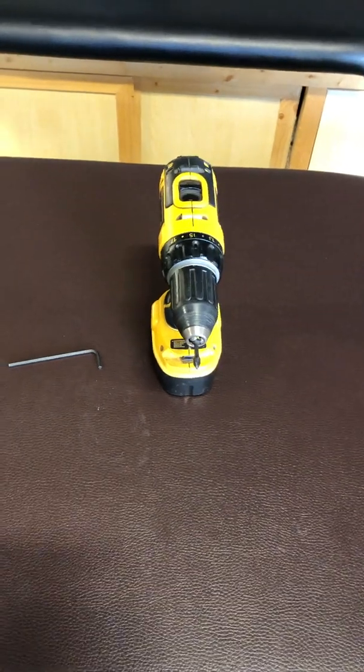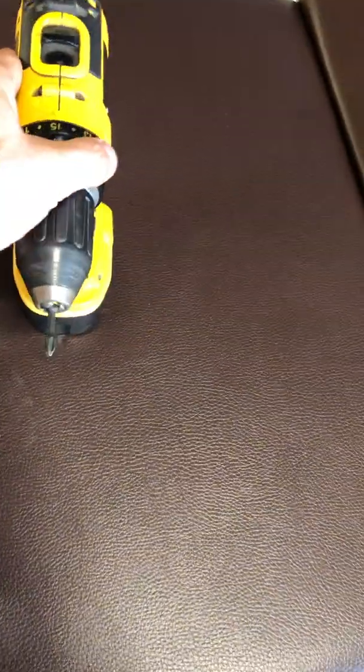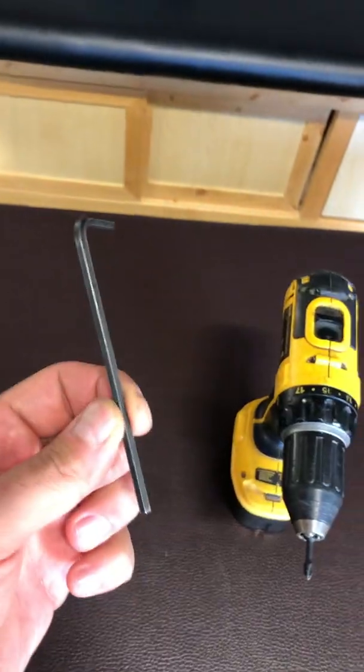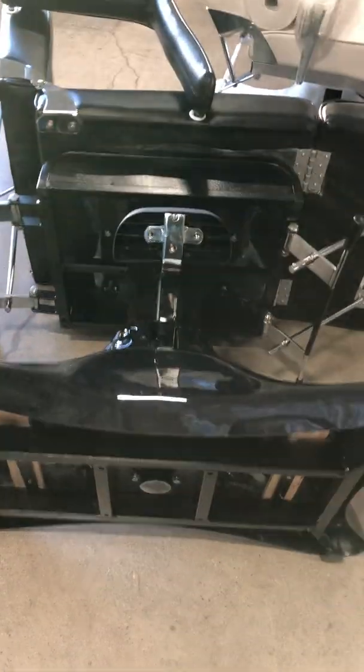All right, so today I'll be showing you how to go ahead and replace the hydraulic pedal pump on the hydraulic bed. The tools you'll be needing are a 4 millimeter Allen wrench and also a Phillips screwdriver. And now we're gonna put the actual table on the sideway.